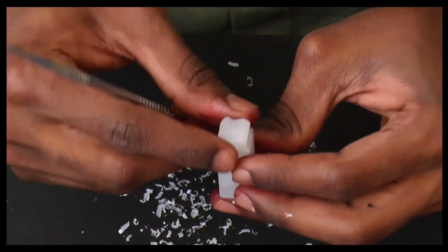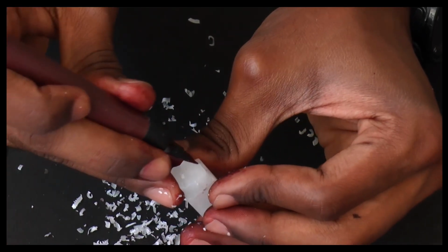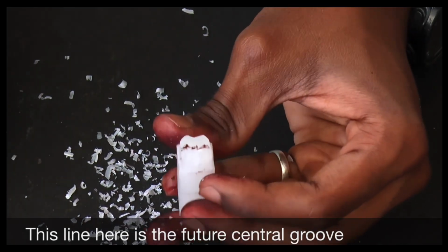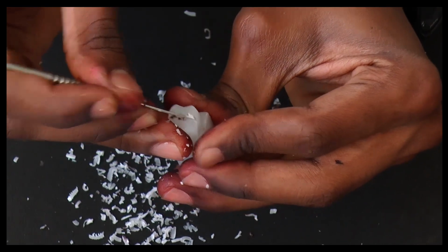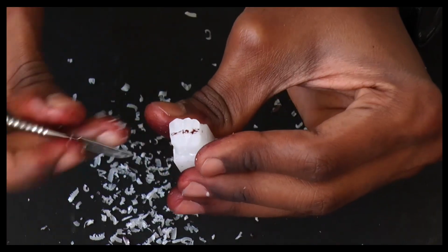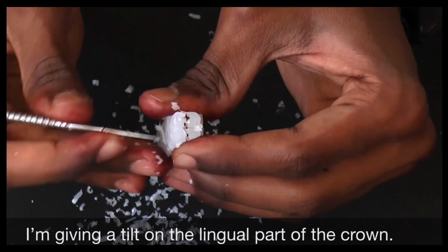The next thing we need to look at is the shape of the cusps here. This would be my line to which I need to build my cusps. So this is my biggest cusp, and we'll be very careful while doing it. There it goes, my biggest cusp. I'll also give a nice tilt here right now.